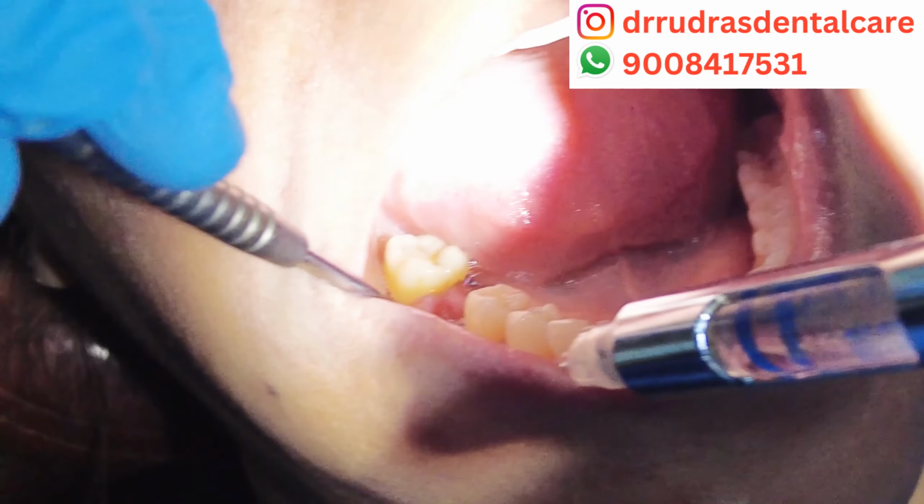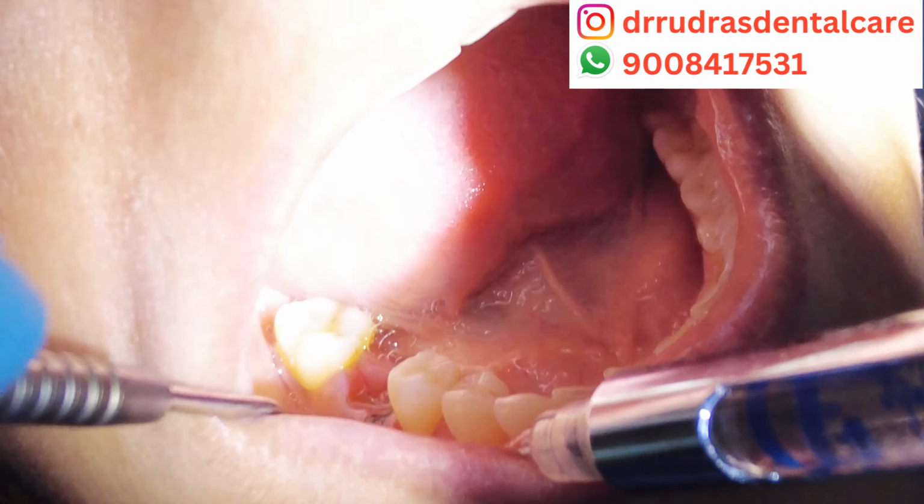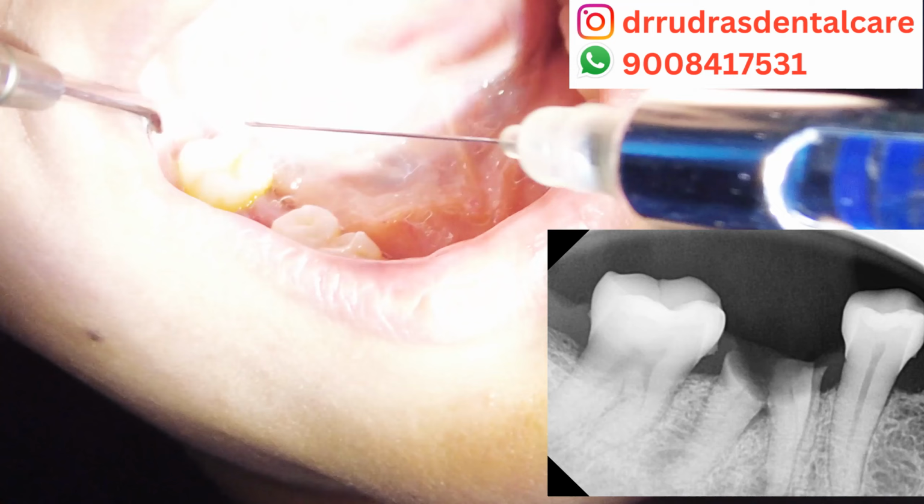Hi, my name is Dr. Rudra Mohan, and today we're going to be watching a video of surgical extraction of two teeth, the lower right first molar and the upper left wisdom tooth, that is the third molar.